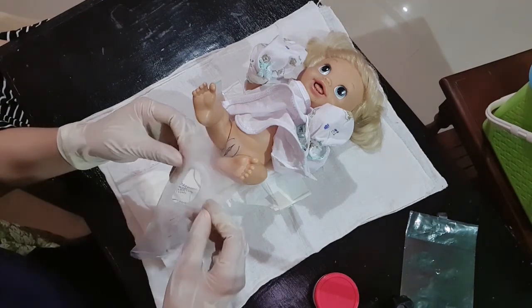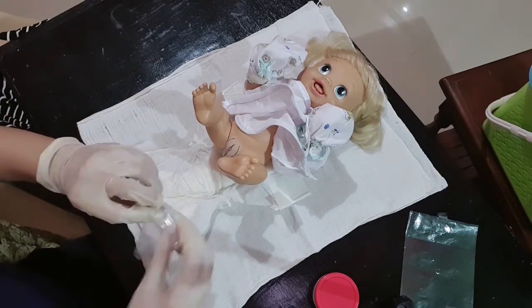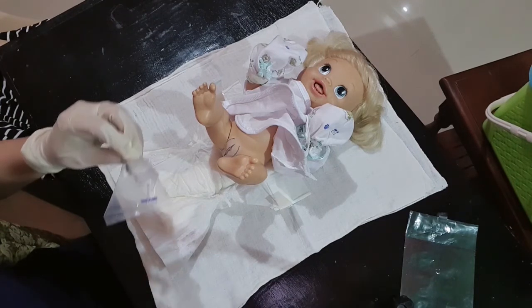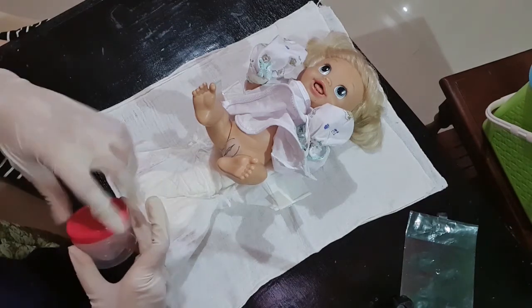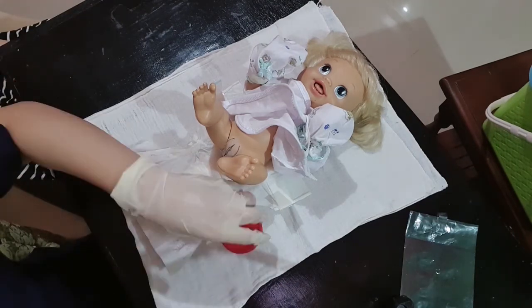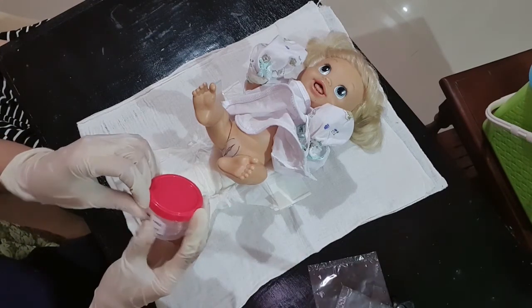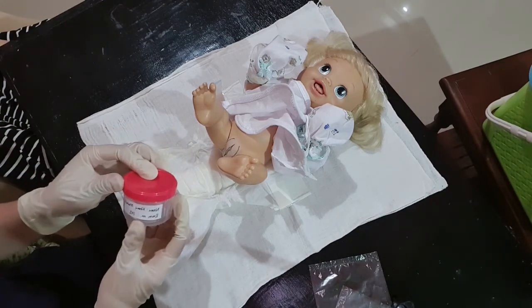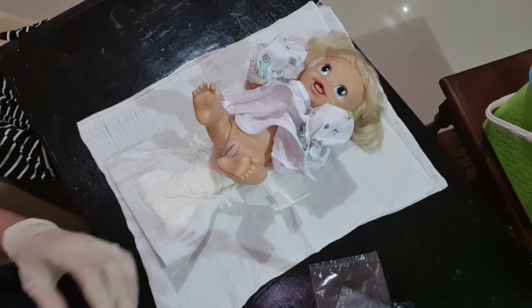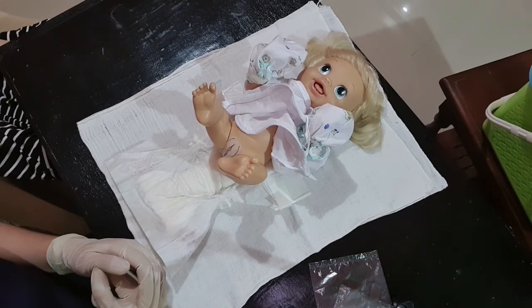Or I can also fold the two adhesives together, then seal it, and then place it again in an appropriate container. Then put the sticker again on the body and not on the lid. This sticker includes also the name and the room number. Rationale, this is to avoid contamination of the urine specimen.